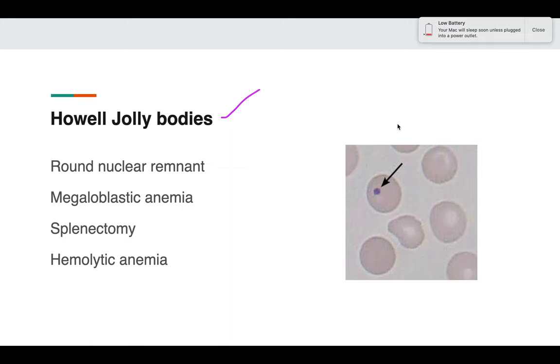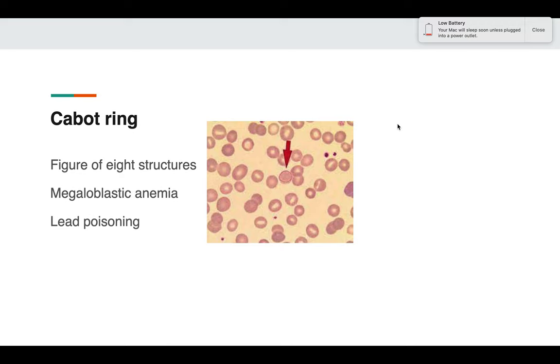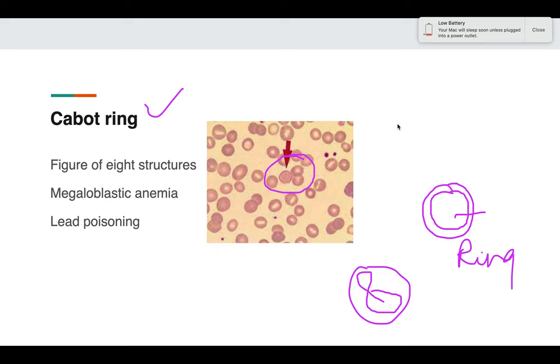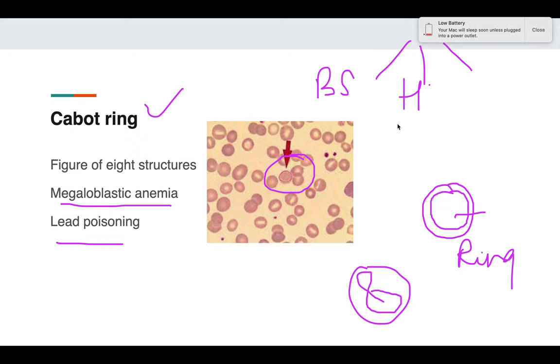Howell-Jolly bodies appear as a small round purplish structure — actually a nuclear remnant of the RBCs. They are seen in megaloblastic anemia, splenectomy, and hemolytic anemia. Cabot rings appear as a thin delicate circular ring inside the RBCs, or as a figure-of-eight structure. Cabot rings are seen in lead poisoning and megaloblastic anemia. In megaloblastic anemia, all three inclusions are present: basophilic stippling, Howell-Jolly bodies, and Cabot rings.